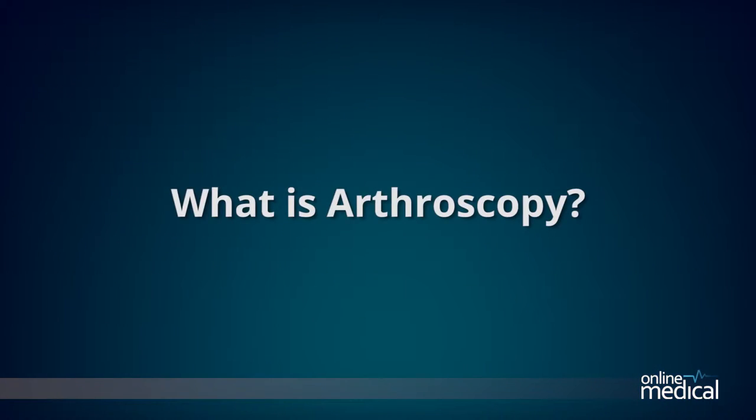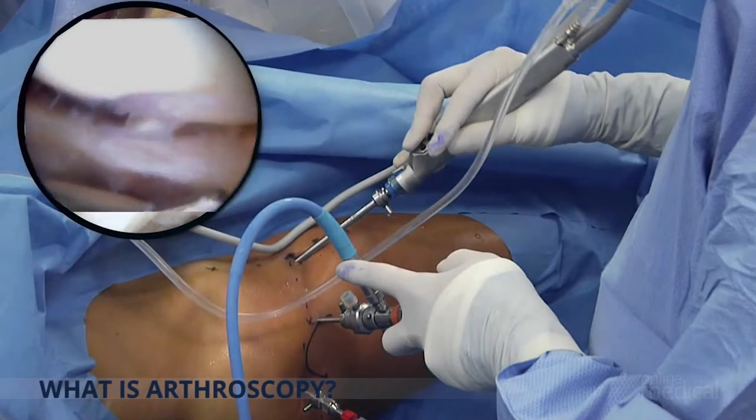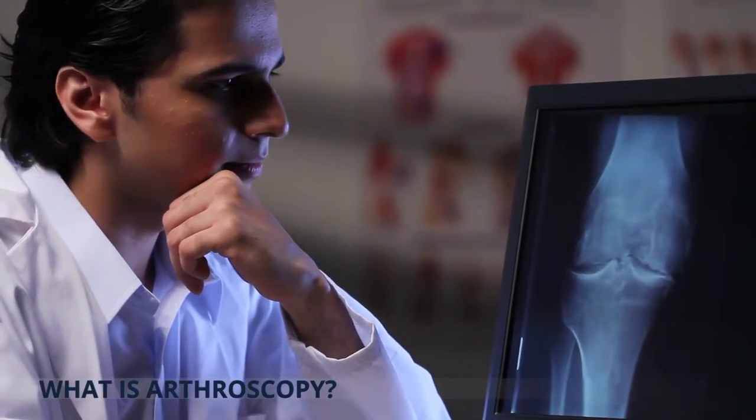So what is arthroscopy? Arthroscopy is a type of keyhole surgery, a minimally invasive surgical procedure that is performed through small incisions in order to evaluate or treat a variety of conditions.